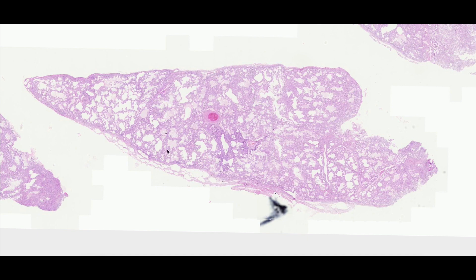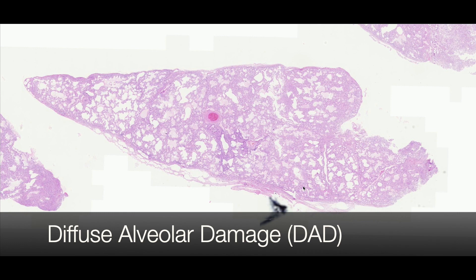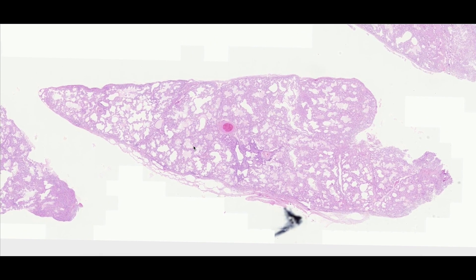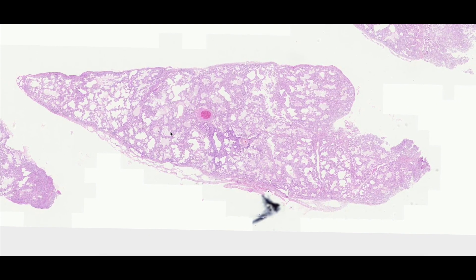In this case we have a case of diffuse alveolar damage or DAD. At low power, notice that this is a diffuse process and the entire lung is markedly abnormal. However, an important point is that these cases can also be patchy — they don't necessarily need to diffusely involve an entire specimen. The term 'diffuse' in diffuse alveolar damage actually relates to the fact that within an alveolar lobular unit the damage diffusely involves all components, but not necessarily the whole specimen. So you can actually have a patchy diffuse alveolar damage process.